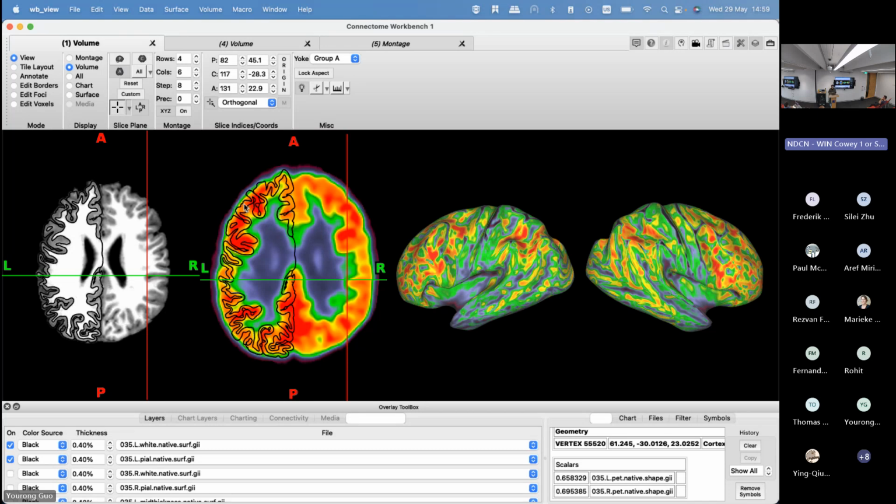Then we use the weight. So the closest have higher weight, the further ones have the lower weight. And we just use the weight combined to sample them inside this little column, inside the vertex in the middle point. You understand? That's how we project them onto this surface.